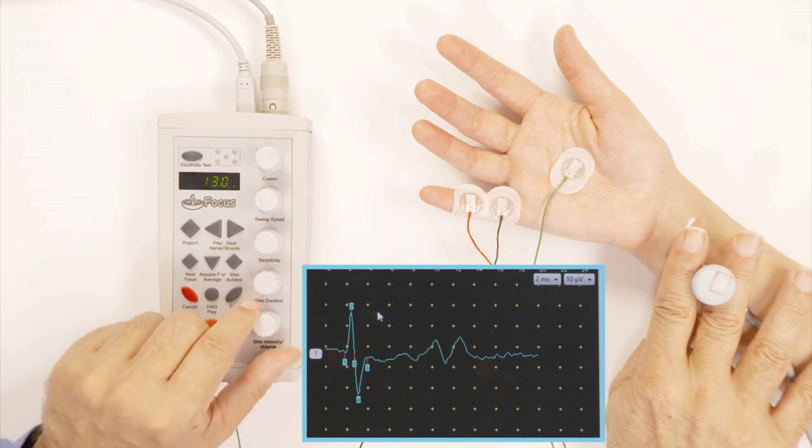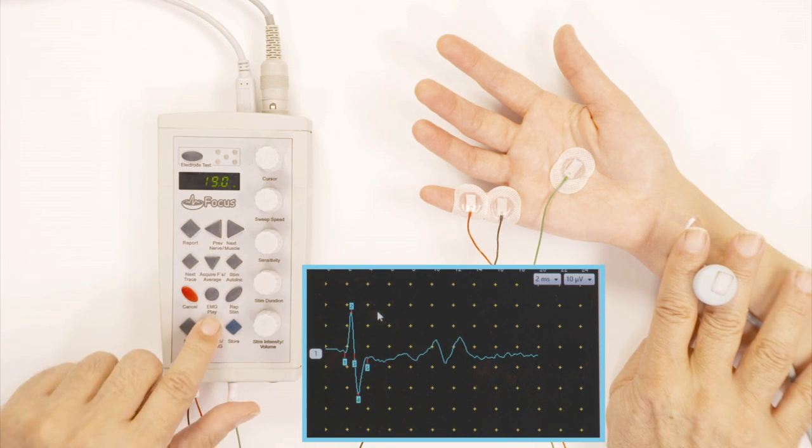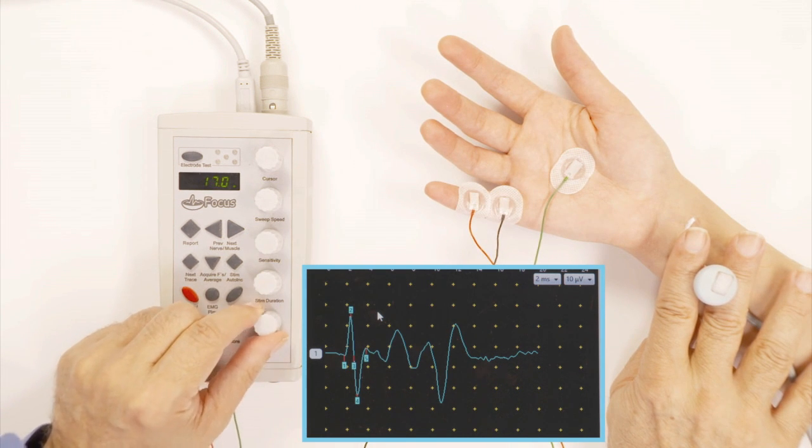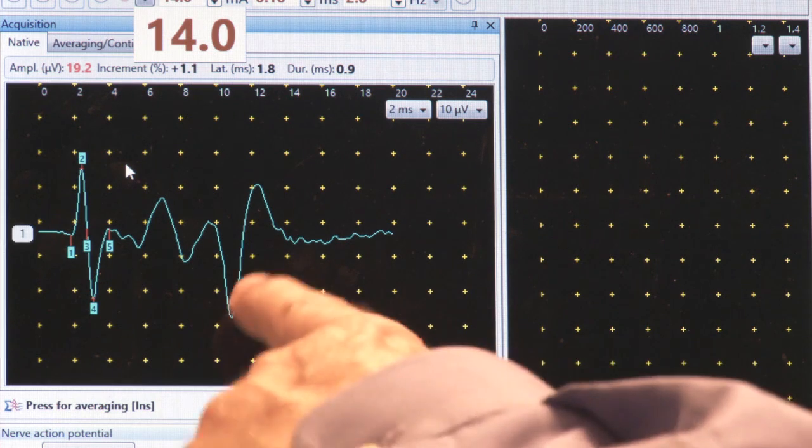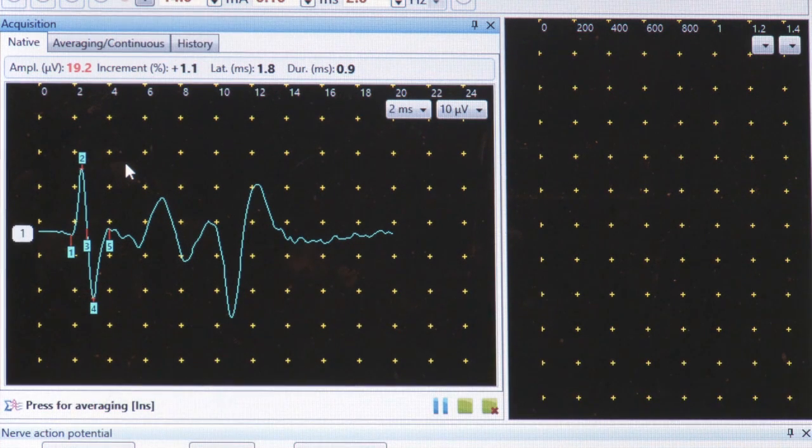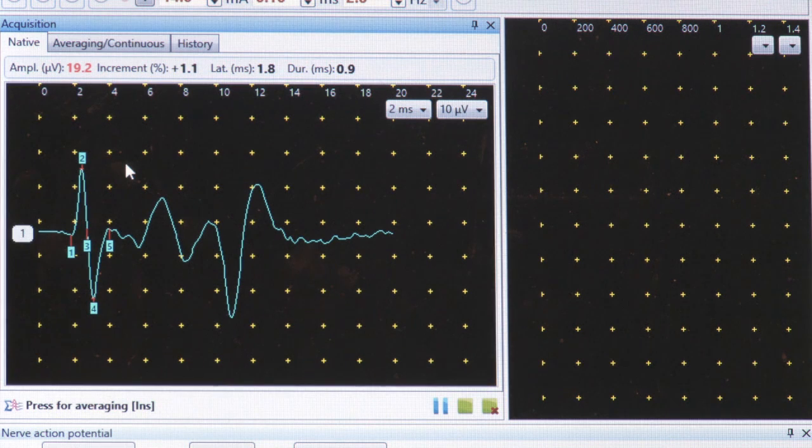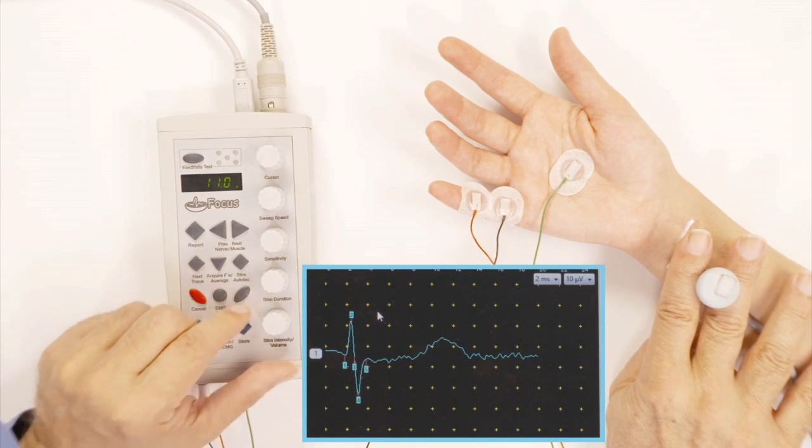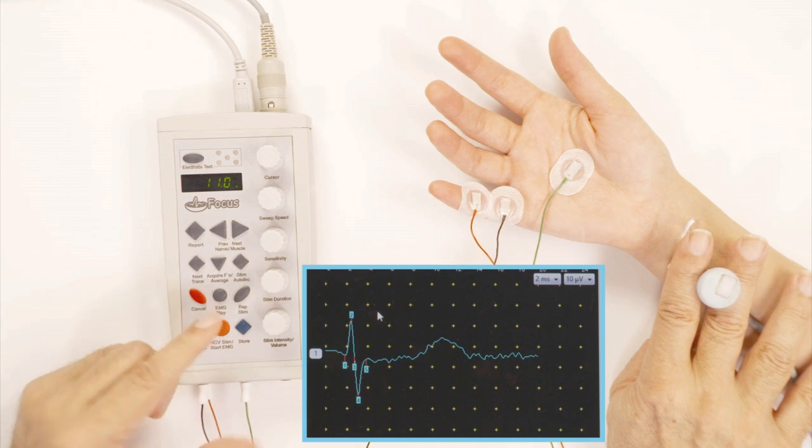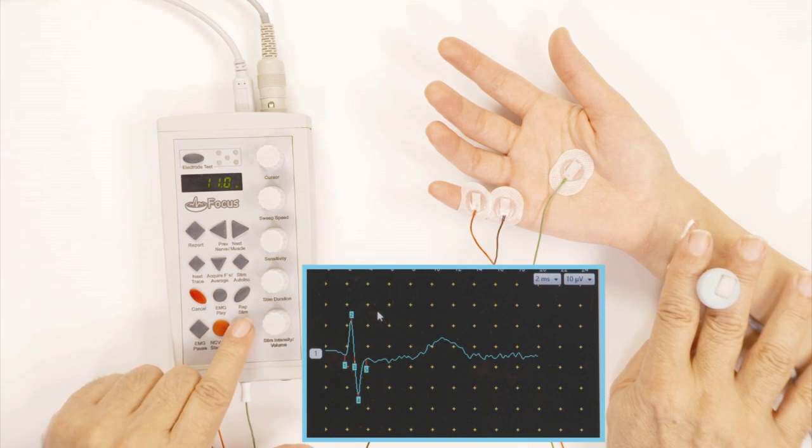By the way, if you put too much electricity, you're going to start seeing all this stuff here next to it—that's the movement artifact. That means that the finger is moving, and it's not actually the nerve itself. So I'm going to decrease the intensity a little bit. Now I'm happy with that, so I'm going to press the green button, which is to store.